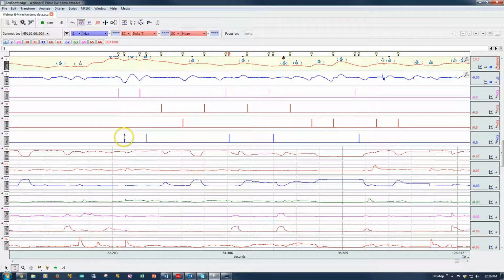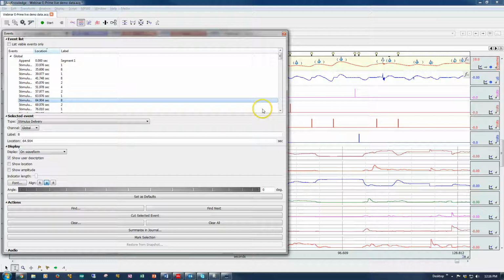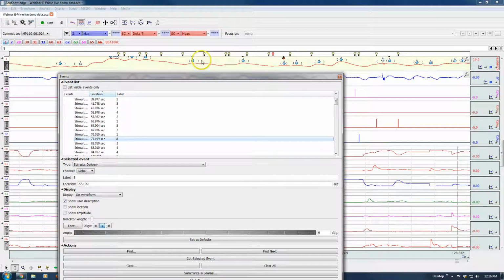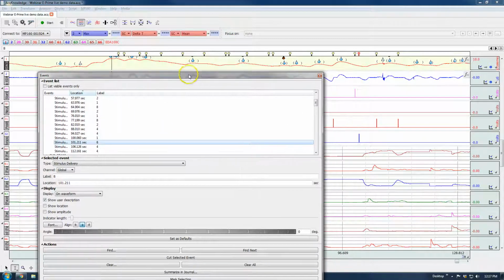And the event that I'm particularly interested in is this response one down here, which is labeled 8. Okay, and if I open up the event palette, we can see there are a number of 8s in there, and I can jump to any one of them. So this is the corresponding one. Keep going. 8. So these correlate to a button response that was pushed by the subject.